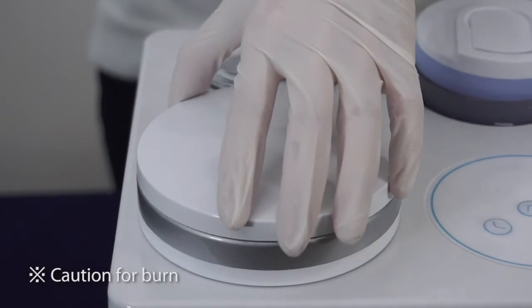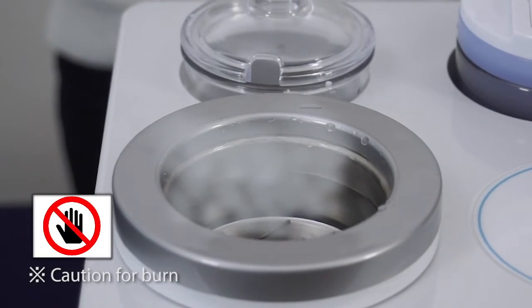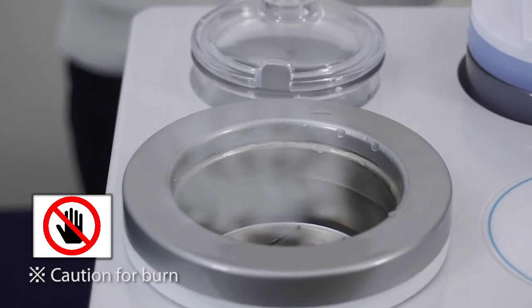When soaking is finished, the water temperature can rise up to 60 degrees Celsius. Use plastic tweezers when you pick the tools up, and change the water after it becomes cool.